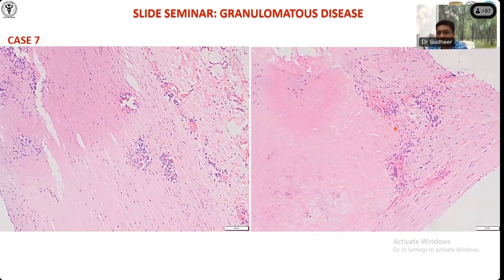And see this fourth area? The whole area is totally replaced by fibrosis, and it is hyalinized. You will see small areas of speckled dystrophic calcification as a degenerative process. If you observe the periphery of this collagen, you have inflammatory cells, you have granulomas, you have multinucleated giant cells, epithelioid histiocytes. Can you see at this magnification? All are there at the periphery of this degeneration.